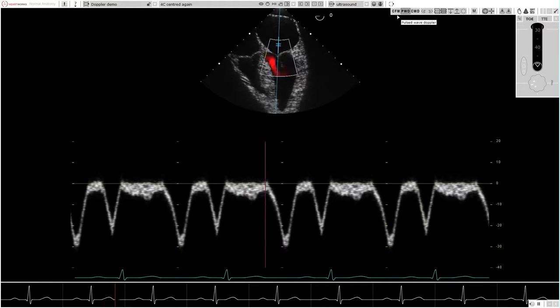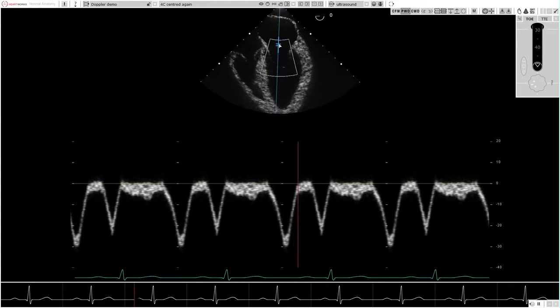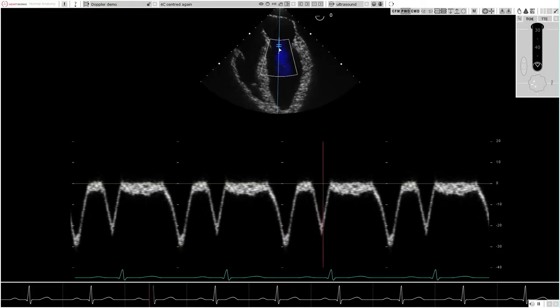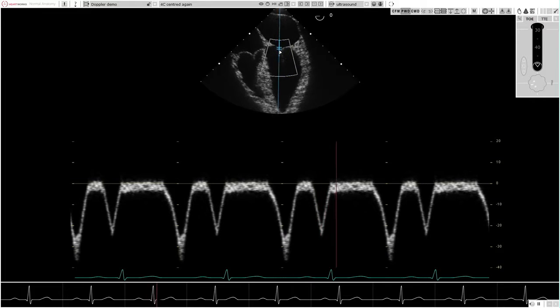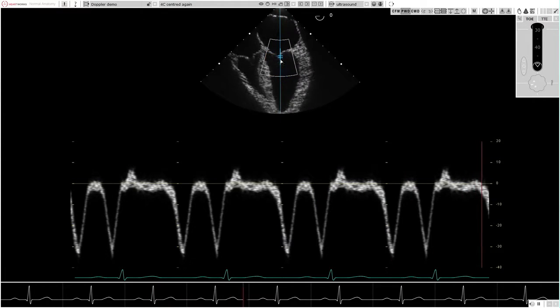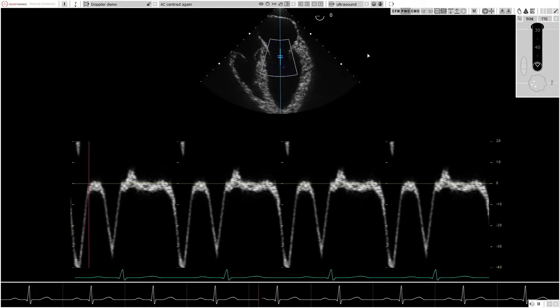Standard Doppler quantification tools such as measurement of peak and mean velocities, velocity time integral, and pressure halftime will be included in the software.